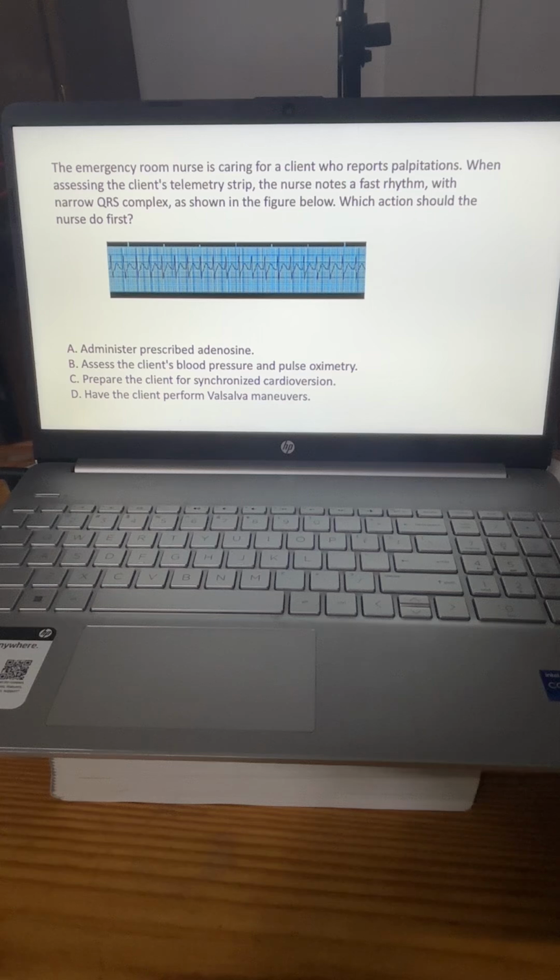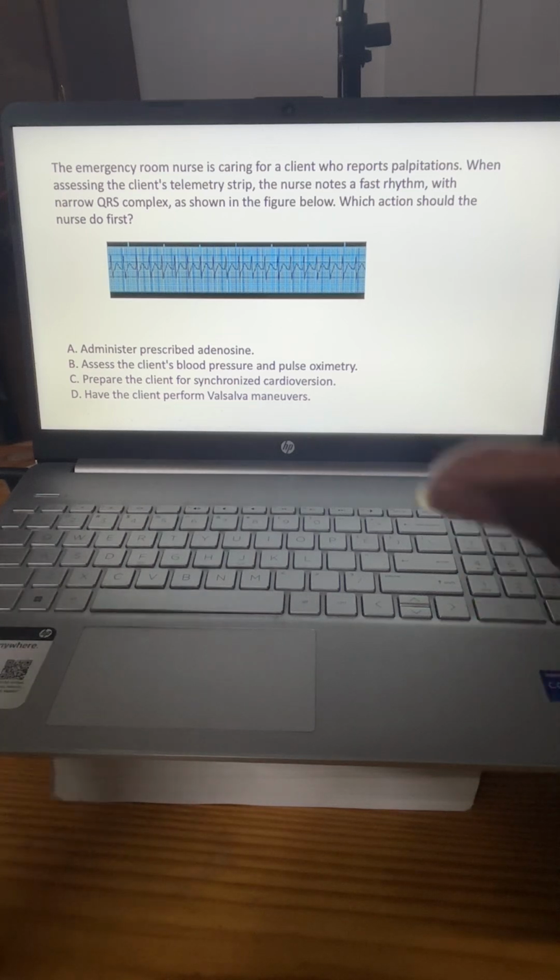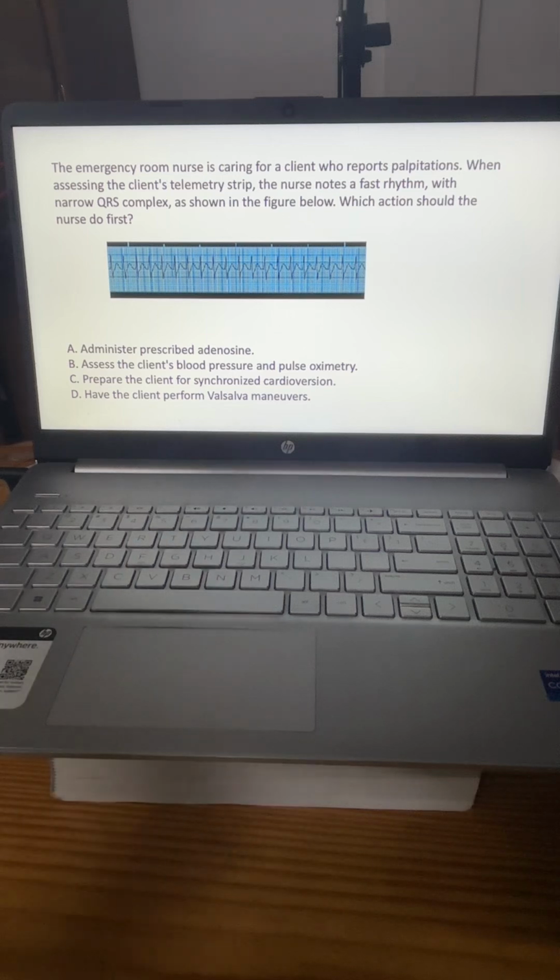You will ask me, why is that my answer? Based on concept. But if you try to use knowledge, maybe you have knowledge about the ECG and the situation, you can look at it and say, okay, A is possible. C, trust me, in this particular question, I'm using concept to answer the question. So I will not really say if C and D are possible, because I'm just answering this question based on concept, right? So based on concept, the answer will always be B.